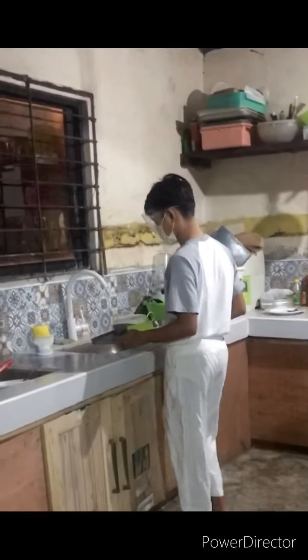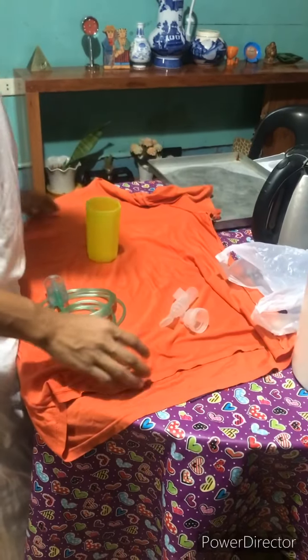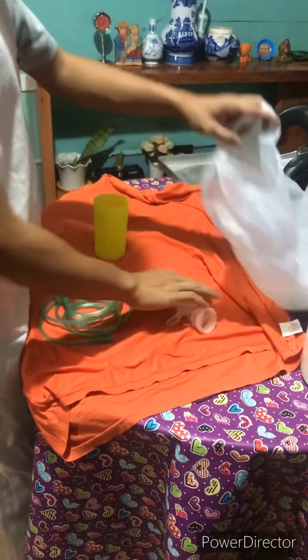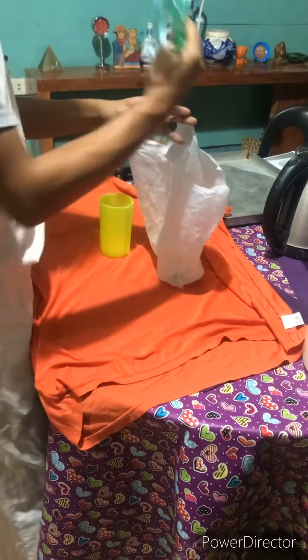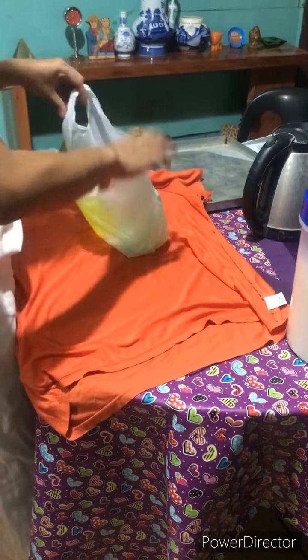Wash and dry the nebulizer tubing and mask or mouthpiece with warm soapy water. Proper cleaning decreases the possibility of pathogens entering the client's respiratory tract. Retain the equipment in a polythene bag for the patient's next administration to prevent infection. The equipment should be changed every 24 hours.